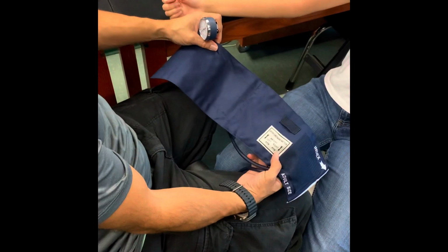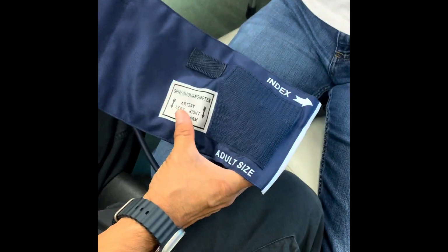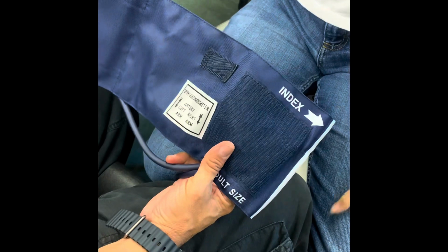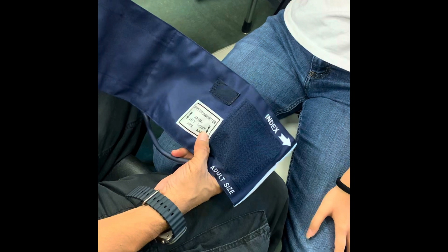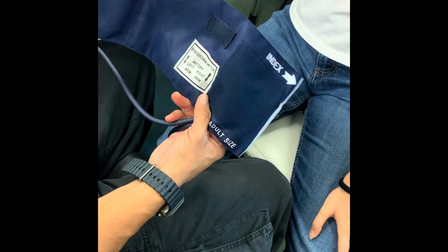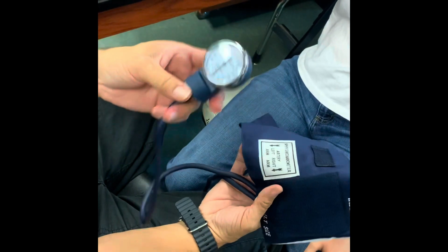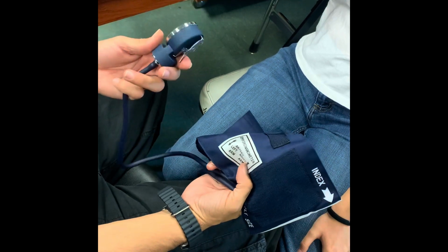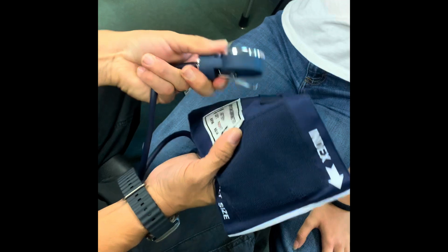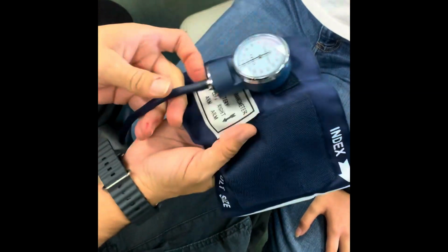The blood pressure cuff is labeled for you as well. It'll tell you right arm, left arm. Okay, and so that is a very good indicator on where the cuff should be placed on the arm in order to take blood pressure. So what you'll do is this might be off of the cuff when you open the cuff up. So you're gonna just use the little clip at the end and you're gonna slide it underneath this little tab and then clip it so it holds.